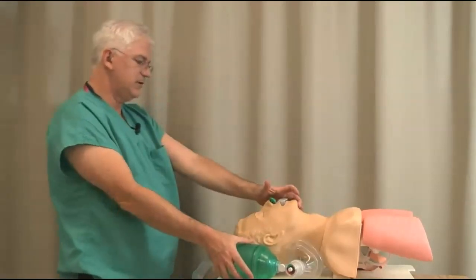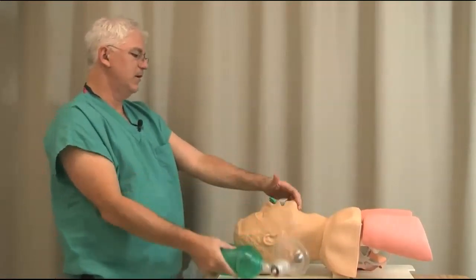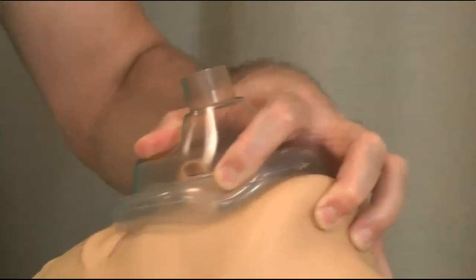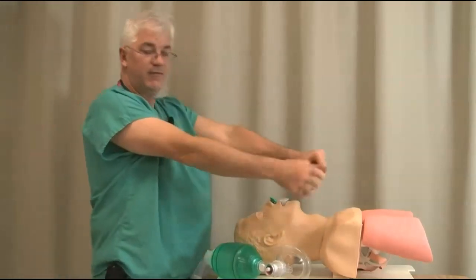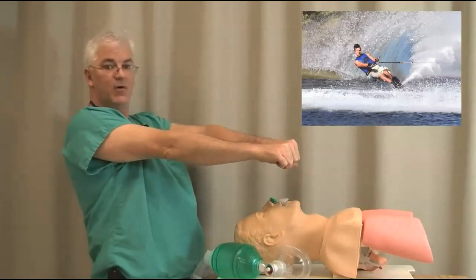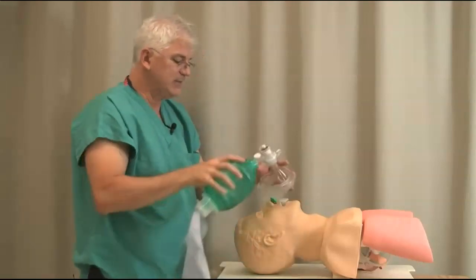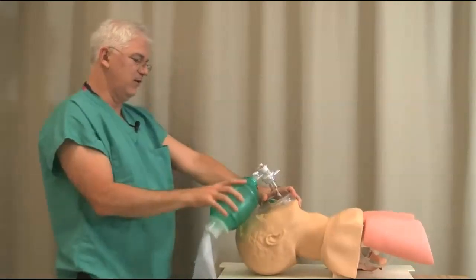Whereas if you watch how I lean back now, see how relaxed that is? I'm holding the jaw and leaning back. All the work is being done by the tendons up here in the shoulder, not by my bicep and hand muscles, which will get tired. Lean back. This is very similar to water skiing. If you water ski, you basically lean back, and you can water ski all day like that. If you try to water ski like this, you're going to cramp up and not be able to water ski very long. And this is for that rare instance that I hope you don't encounter, where you have to mask for a very long time.